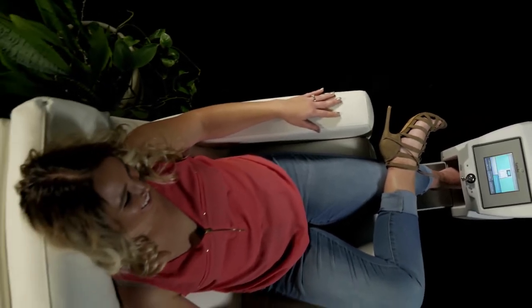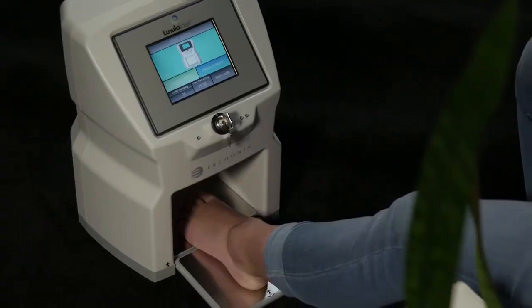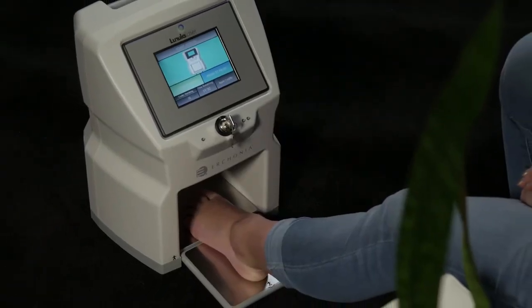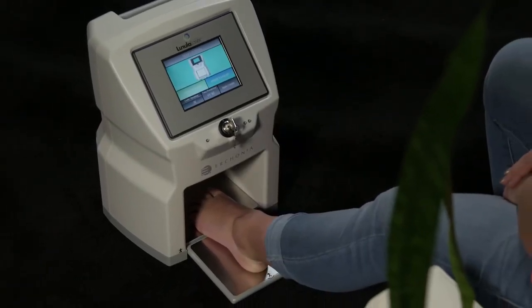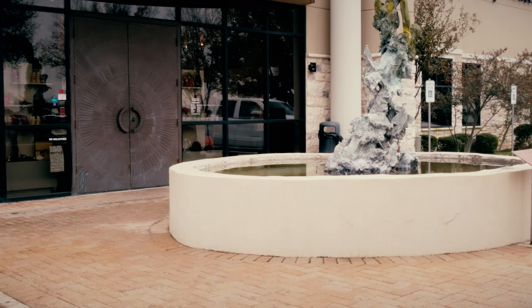A new weapon in the war on toenail fungus has arrived. Fight it with Lunula. The Lunula laser is a pain-free procedure that has been proven effective to stimulate new clear nail growth without the risk of harmful side effects. Ask your doctor if Lunula is right for you.